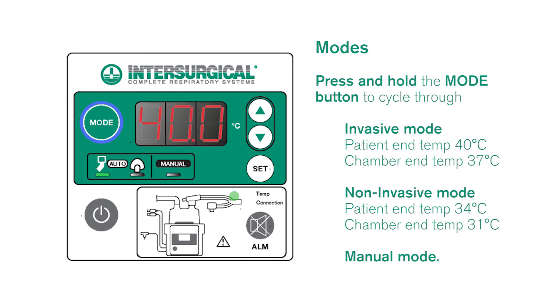Press and hold the mode button to cycle through invasive mode, non-invasive mode and manual mode.